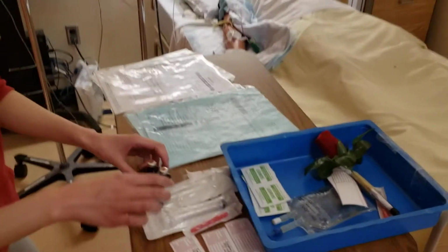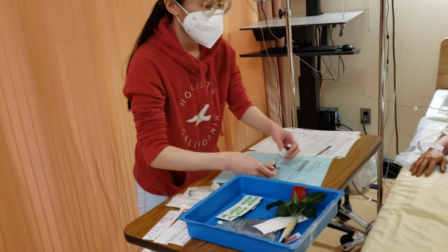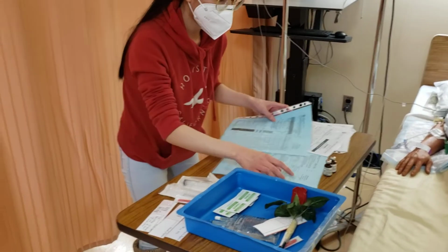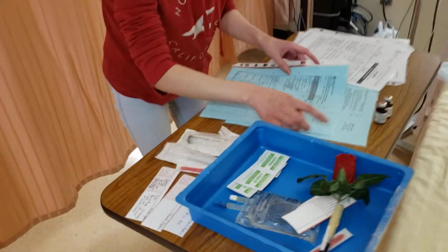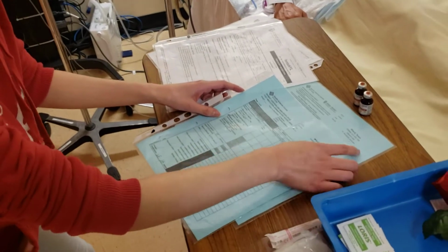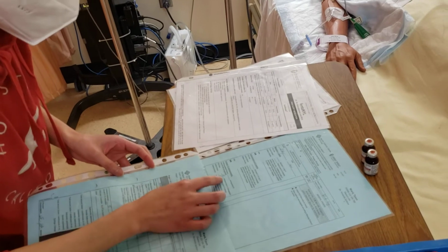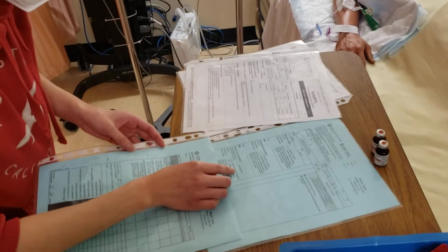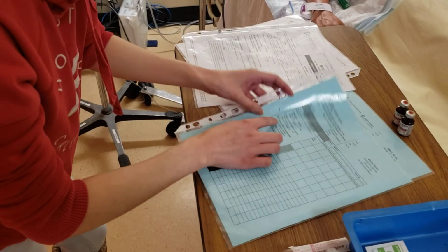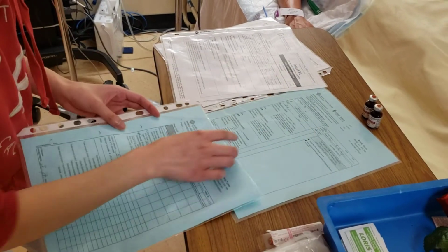I have my supplies ready, and I'm going to do my first check of the MAR and the doctor's order once again. Ward Tyson, PIN number 123456789, 24 years old, and the doctor has ordered fentanyl 10 micrograms per ml. And same thing here: 10 micrograms per ml, a PCA dose of 10 micrograms, a lockout of 5 minutes.